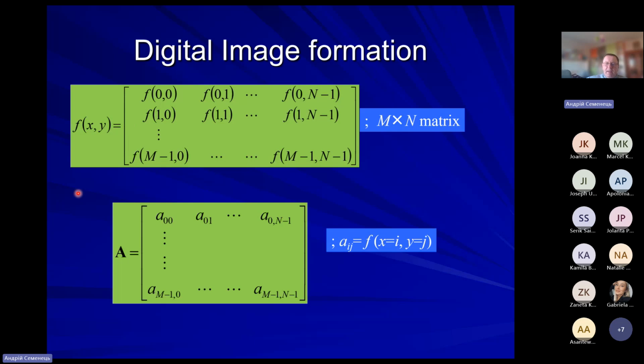So here above, again, we are talking about mathematics. Above, we have the original matrix of continuous signal which had been illuminated over each sensitive element. So here we have a matrix of continuous signal for each pixel, and below we have its digital representation, some quantified value, a single value which reflects some specific level of this original continuous signal.